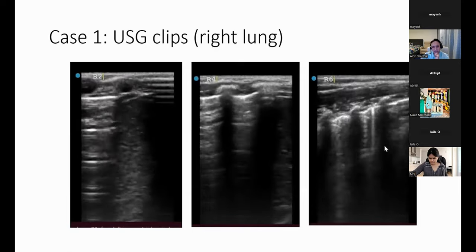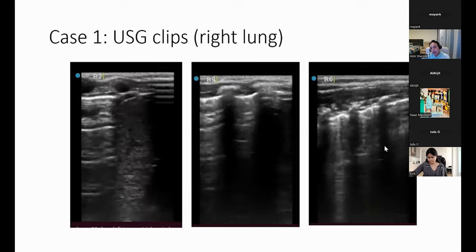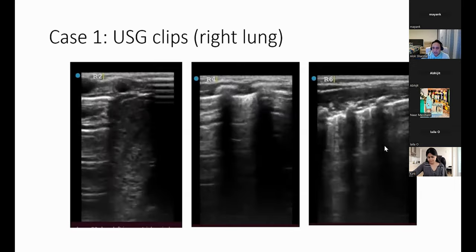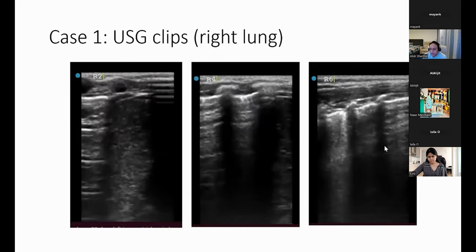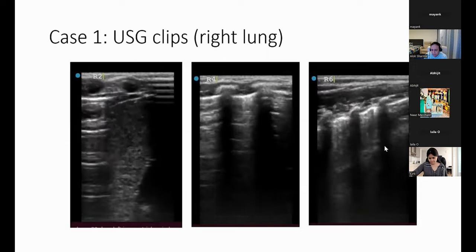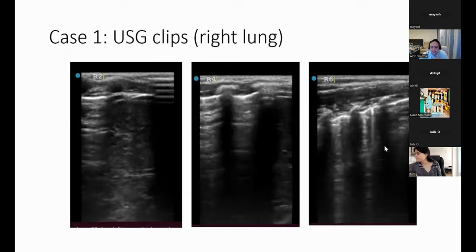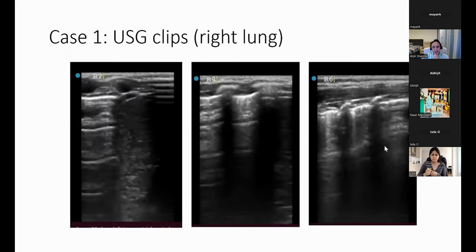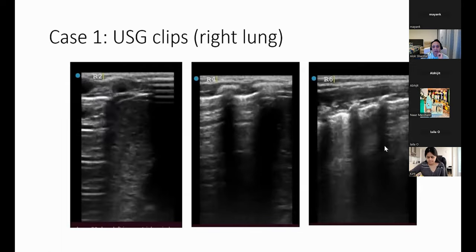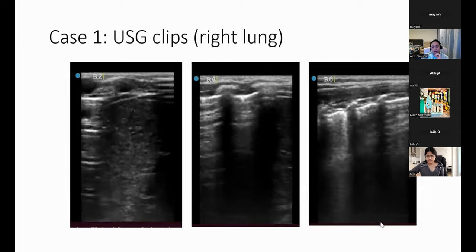Now, I'm going to be honest, I think some of what you're seeing with the pleura being irregular, again, is because you're not completely at 90 degrees. To be at 90 degrees, if the baby is prone and you're examining the back, sometimes the probe becomes oblique, or the upper half of the probe loses contact, as you can see at the top end of the margin.